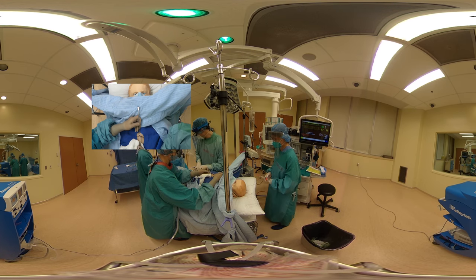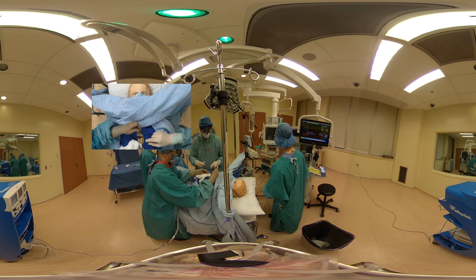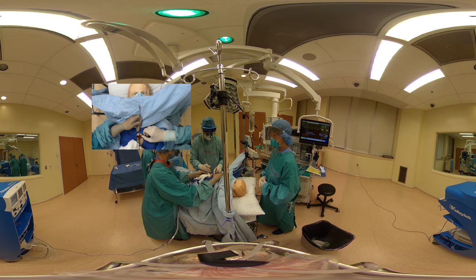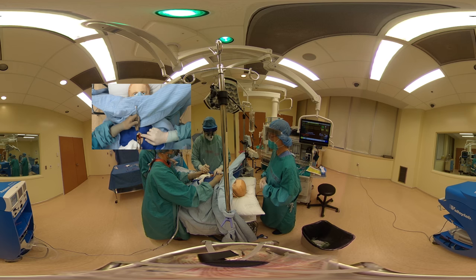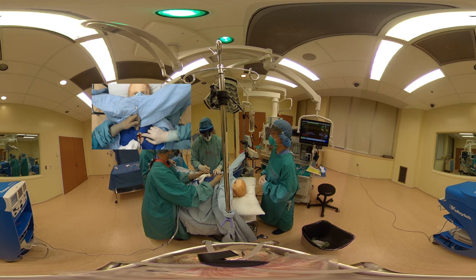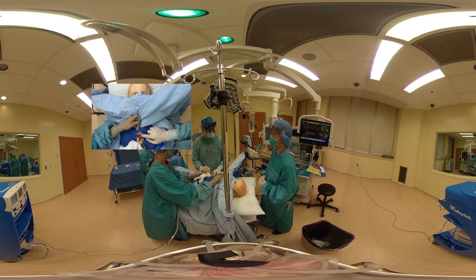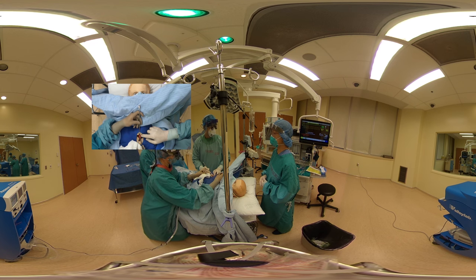Looks like the trachea is exposed there. So we have good exposure of the trachea. Normal looking anatomy, very, very good exposure. Thin, favorable neck. I think it would be an easy insertion of the tube.